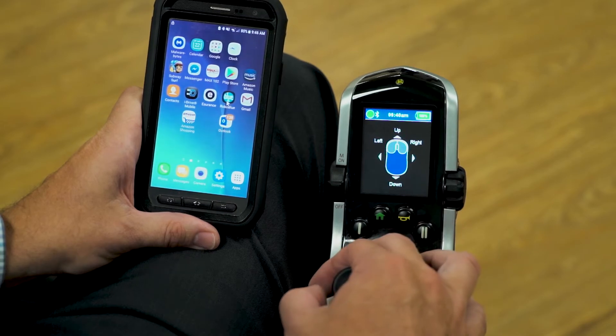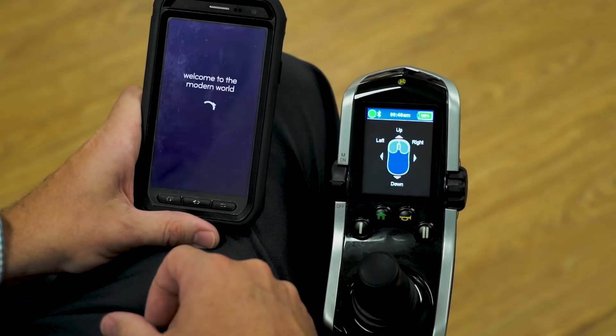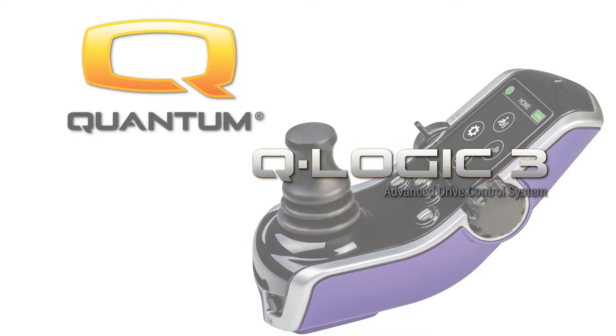Very simple to set up. I have full use over all of my Android phone at this point. If you have any questions about pairing your Bluetooth chip and your Q-Logic 3 expandable electronics, and the video did not answer them, please contact your local Quantum representative for any answers to questions that you have.